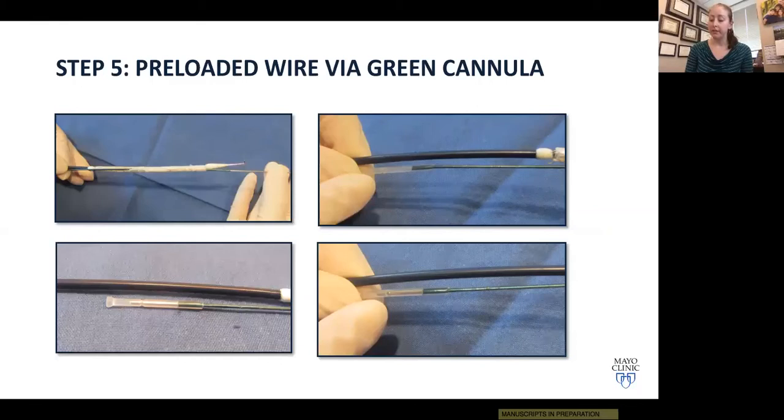Step five is preparation and deployment of the IBE main body. The device comes with two stylets that need to be removed on the back table. The first is in the lumen through the main body — remove it and load the device over your stiff Lunderquist wire. The second stylet is in a green catheter; once removed, this is where you load the through-and-through Metro wire. You must see and feel the wire stopping at the clear tip of the catheter — that confirms the wire has passed through the gate and is appropriately preloaded. If you don't see that, the wire is not properly placed and you should start over.